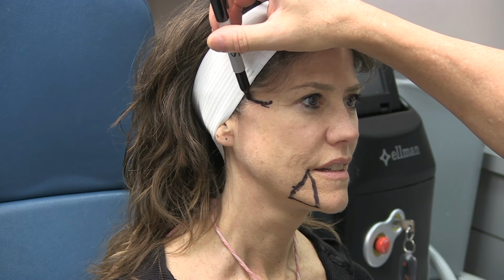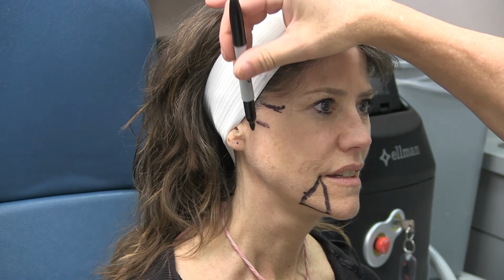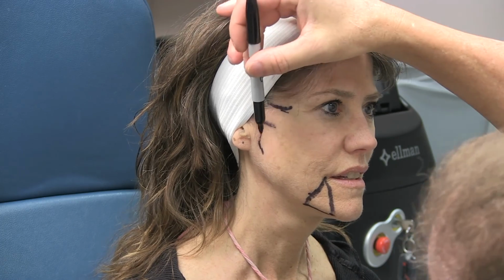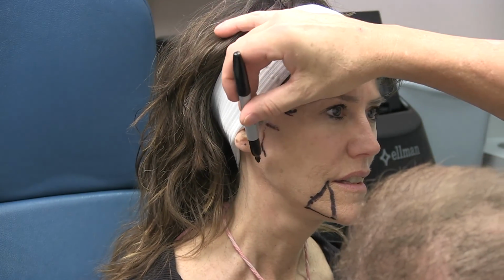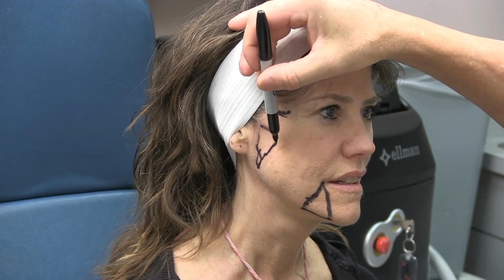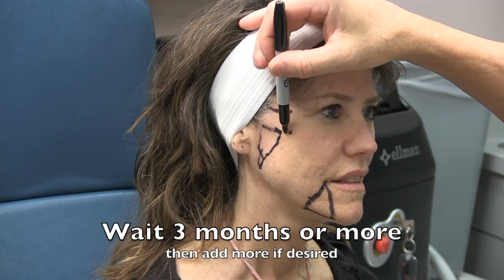It's essentially like a mild inflammatory reaction that attracts just a little extra fluid for 3 months. So if you're correcting the entire lower lid hollows and upper cheeks, then you can use up to 1 syringe per side. But I prefer to correct it by less than 50% and use half a syringe per side, and put the other syringe in 3 months or later. This way you never get a lot of fluid collection in the lower lids.